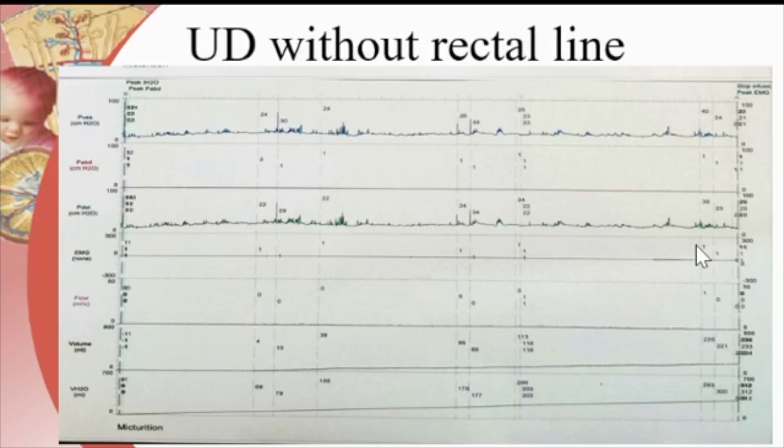But in some patients where there is severe rectal incontinence and the rectal sphincter is also gone, you may have to do it. But as I said, you can look at it indirectly. If you look at this curve, it is pretty much flat. It is not rapidly rising, so the compliance is okay. If you look at the contractions, these are acute contractions like a cough or some crying, but there are no smooth contraction waves like an unstable contraction.